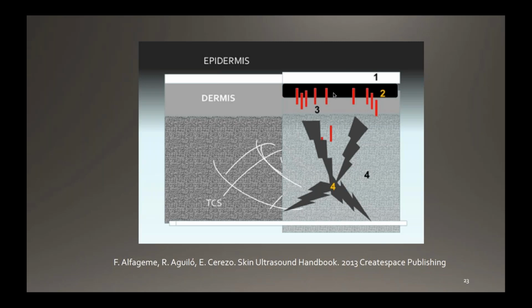This possibility of personalization of individual medicine for your patient is something that is very valued by dermatologists. And our patients now, when we are doing treatments in inflammatory skin diseases, demand this ultrasound from us. Because we teach the patients to see the dermatologic ultrasound, they can see that inflammation is more or less.